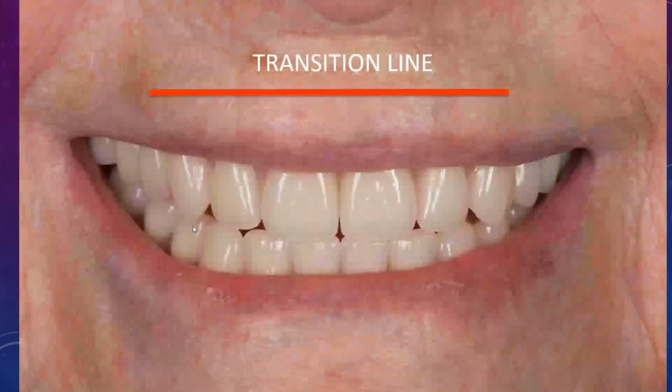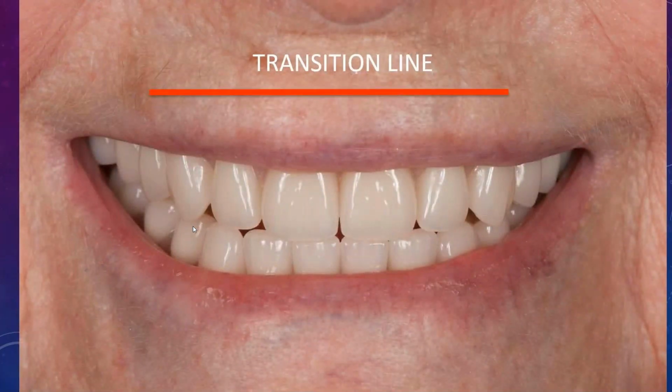Okay. Transition line we talked about already, guys. Very important part, especially if you're doing a hybrid type of restoration. You want the transition line to be above your smile line. Okay. So when the patient smiles, you don't see that little change from the prosthesis to the gingiva. So that's a very important aspect to consider. So when you're planning things, if you have a denture, have them smile really, really wide, or just as wide as they can, or make them laugh, or record them on video making them laugh, and you just measure that distance doing a screenshot. So don't make the same mistake. We've made this mistake a few times, guys, and it just becomes a nightmare down the line.